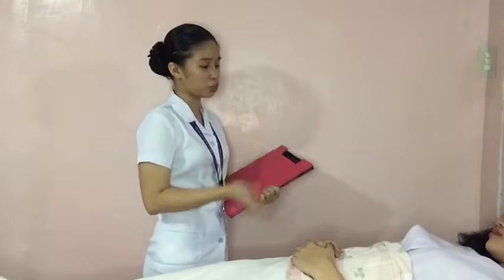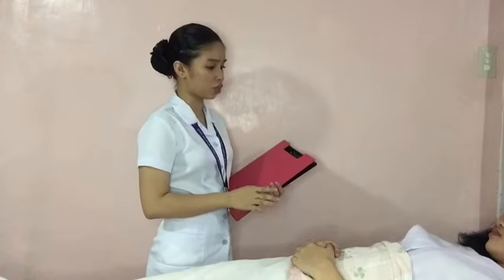Anything you want. Okay, Mary, the procedure that I will be doing is the urinary catheterization. This is based on the physician's order, and it will help you to relieve your acute urinary retention. Of course, I will be touching some parts of your body. Is that okay with you?